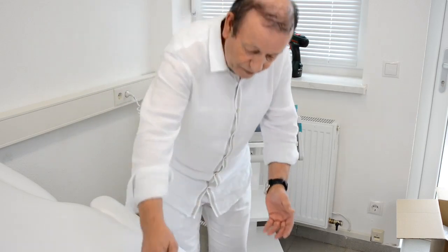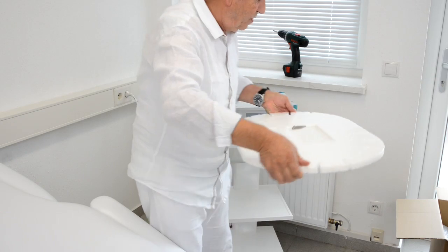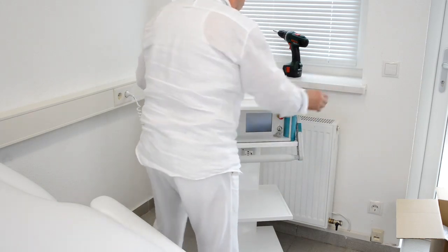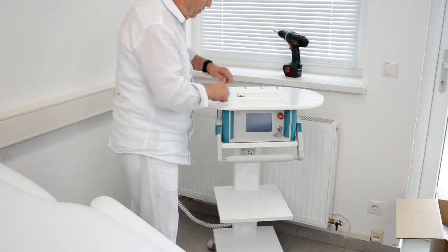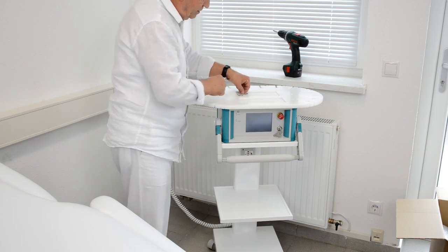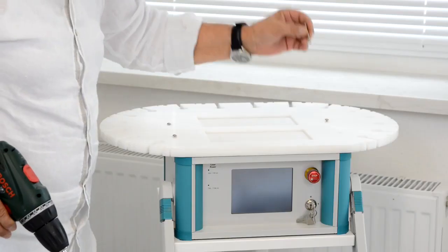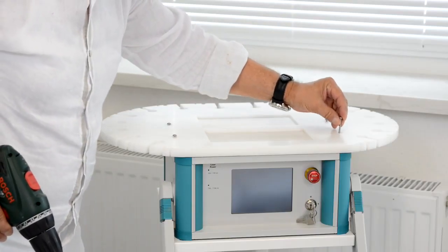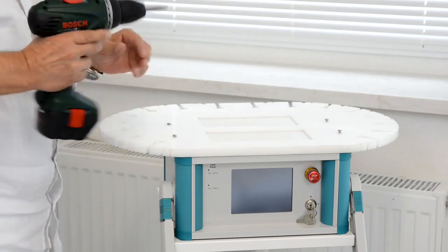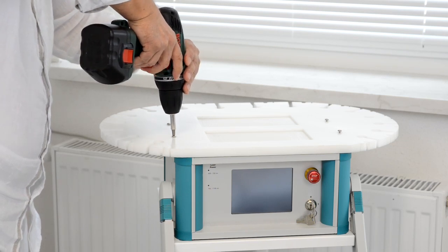So in the next step I take the holder plate for the different laser models and we can put it on the device, and you see there are 4 holes with which we can fix the holder plate with the screws on the device. So now we put in the screws in the holes directly over the holes in the electronic device, and now I fix them with this drill machine.